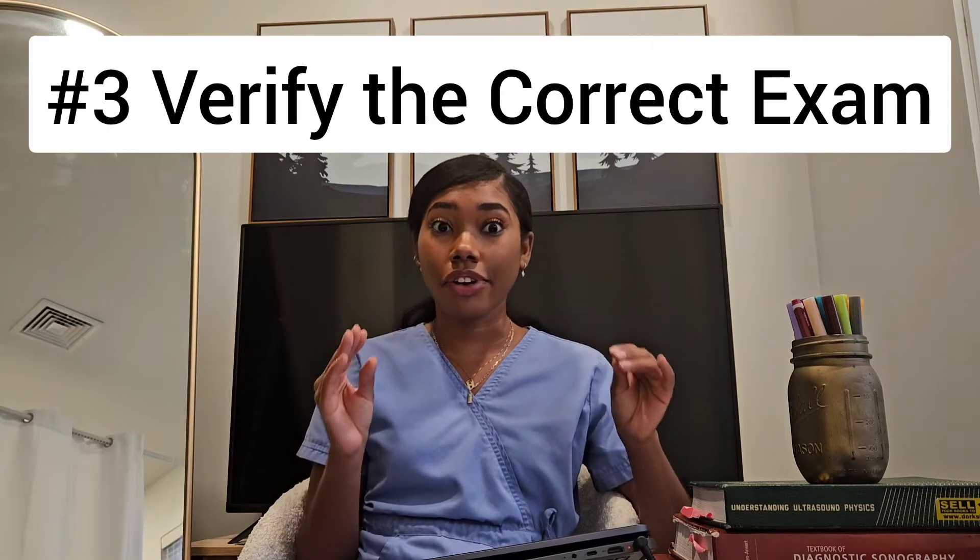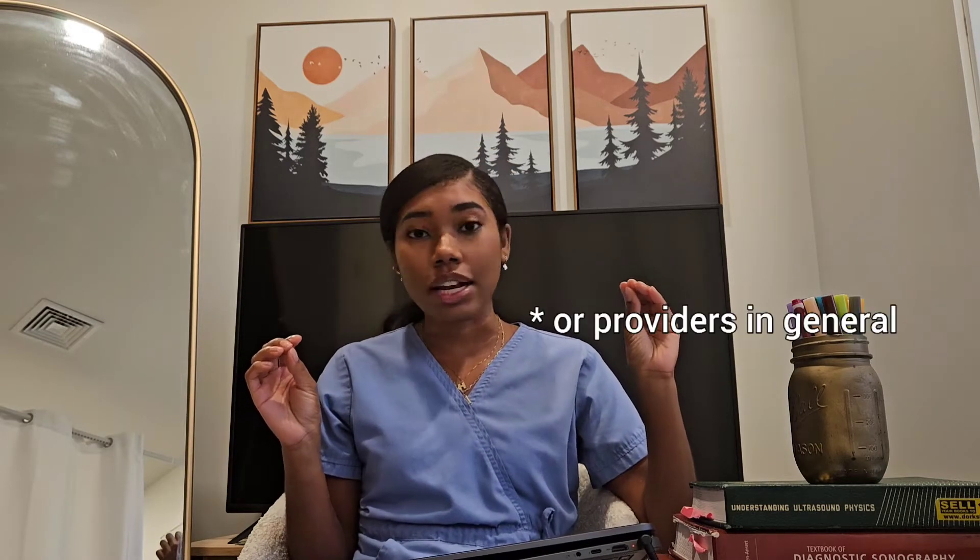Next, you want to verify the correct exam. What I usually do is explain what the exam involves before I begin. This benefits not just the patient but also myself. When I explain what I'm about to do, they can say, 'Wait, my pain is actually over here — why are you checking over there?' And listen to the patient. A lot of times doctors are not even listening to the patient, or they've documented the wrong laterality or something of that nature.